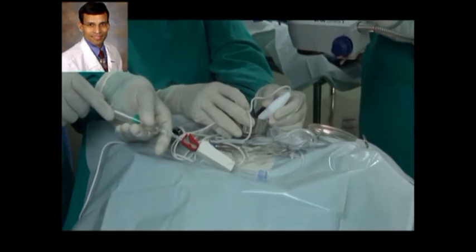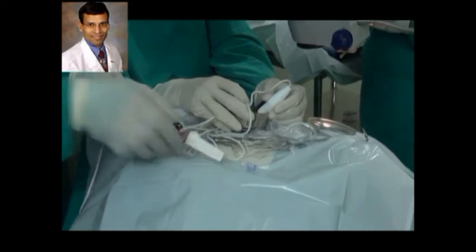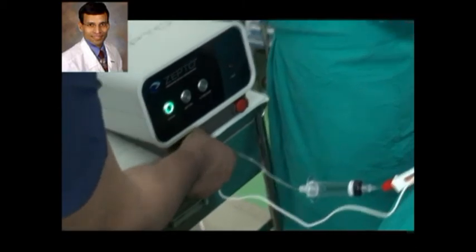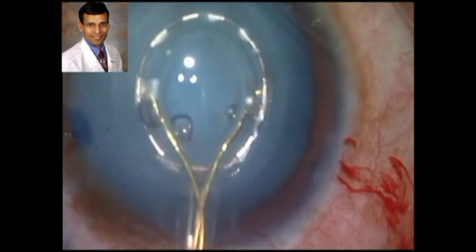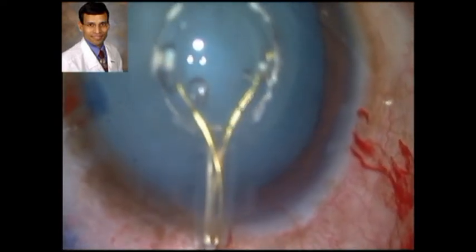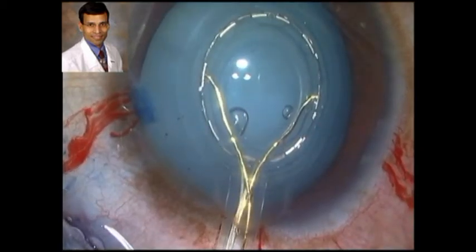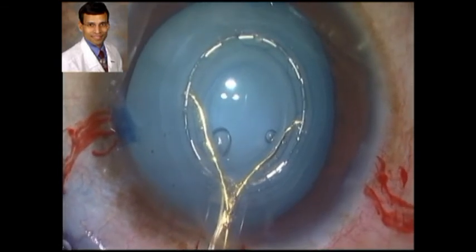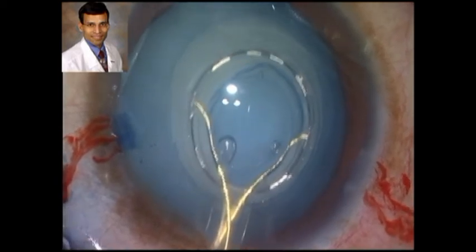Once the entire tubing is filled with BSS, we use this red button to lock the handpiece, and after this we attach the tubing as well as the electrical wire to the console. Once the surgeon is happy with the positioning of the device, he asks the assistant to apply suction by pressing a switch on the console. Once suction is applied, the water molecules between the handpiece and the capsule are vaporized, creating the capsulotomy with the energy pulses that are delivered.